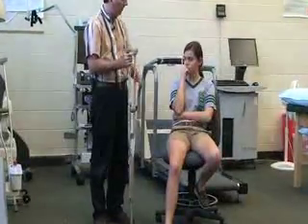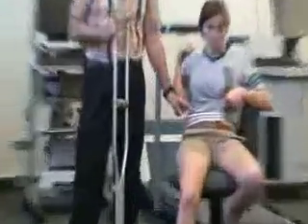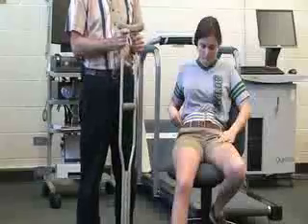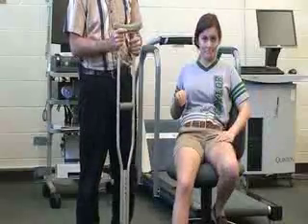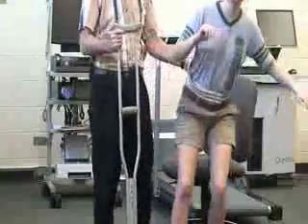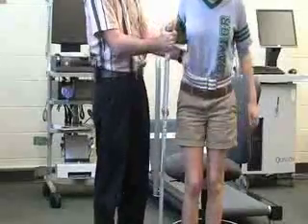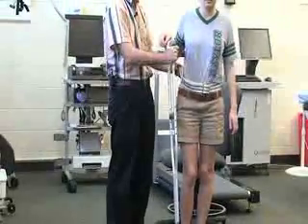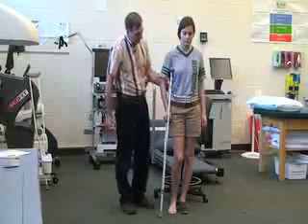Once the crutch is ready we also want to make sure that we have a gait belt on. The gait belt is already applied, and we'll use that to hold on to in order to assist her, rather than having to hold on to her pants or her shoulder. I'm going to help Katie up. Once she gets into a standing position, I'm going to have her stand up as straight as possible, and we're going to put the crutch tip about six inches forward and six inches to the outside, and she's going to put that under her armpit.